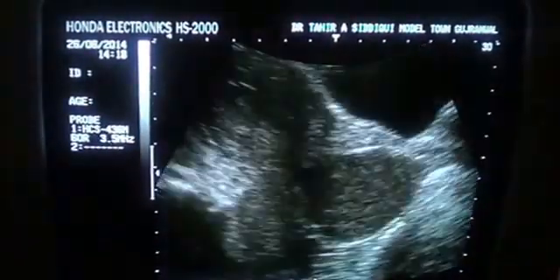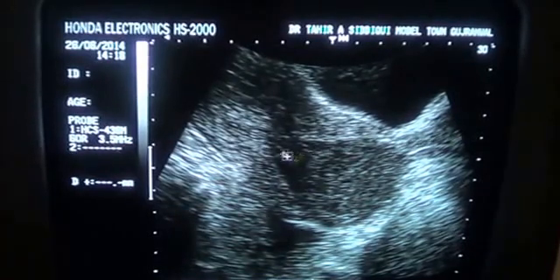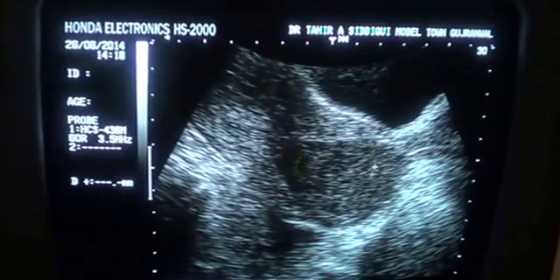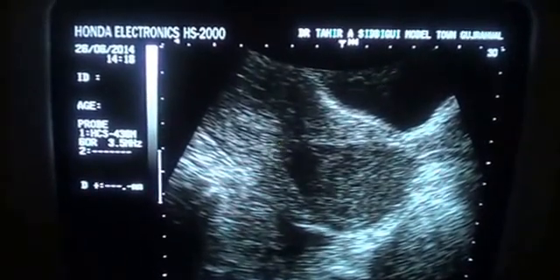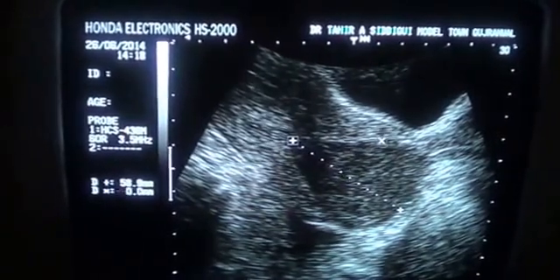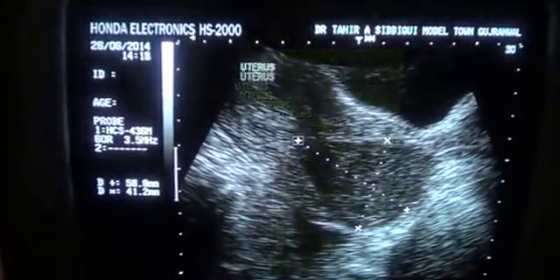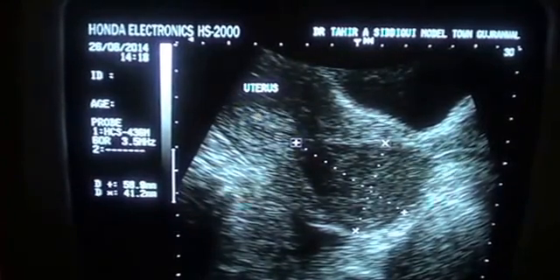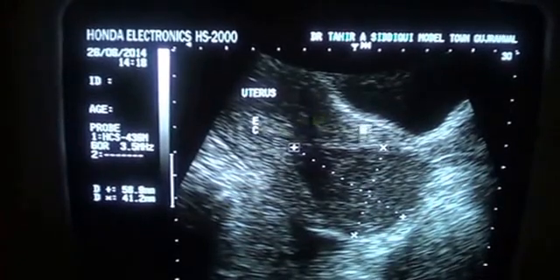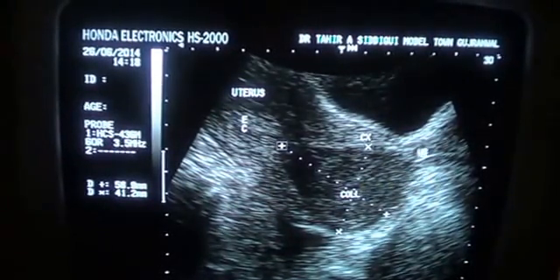Let's see a magnified view. Now in this magnified view you see this is the vagina, this is the internal os, there is fluid, clear fluid over here, and this is all collection. This is the anterior lip of the cervix, this is the urinary bladder, and internal os it is. So this is the body of the uterus. Fundus is being cut off in this view. This is the endometrial canal at the body of the uterus, and this is the cervix, collection, vagina. So it is bounded laterally by the vagina and medially by the internal os.